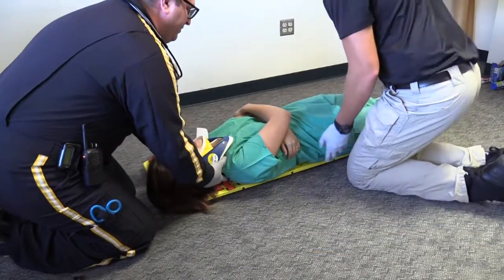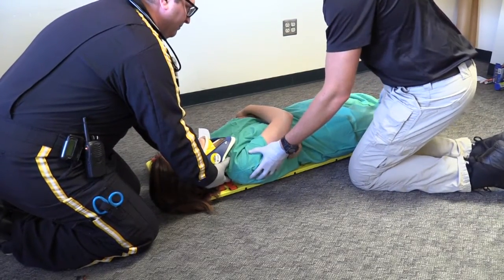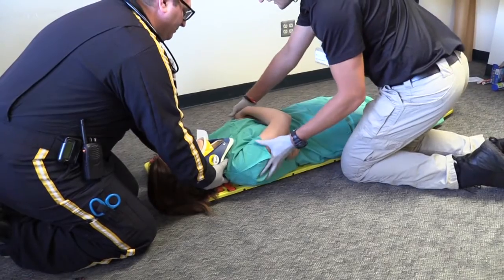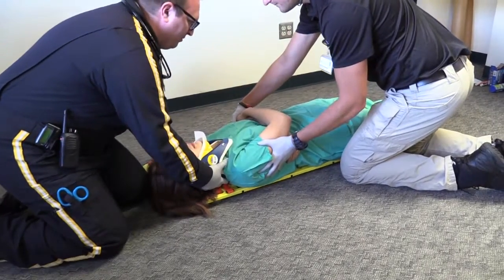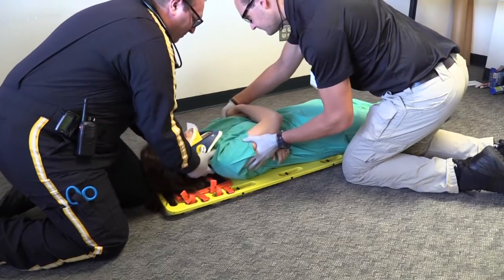The person holding cervical immobilization will again direct the patient being rolled back down onto the long spine board. The patient will need to be moved laterally to ensure he or she is secured to the center of the board. This will mean the person holding cervical immobilization directs the team in sliding the patient down and towards the center of the board and then back up so the patient's head is at the top of the board.